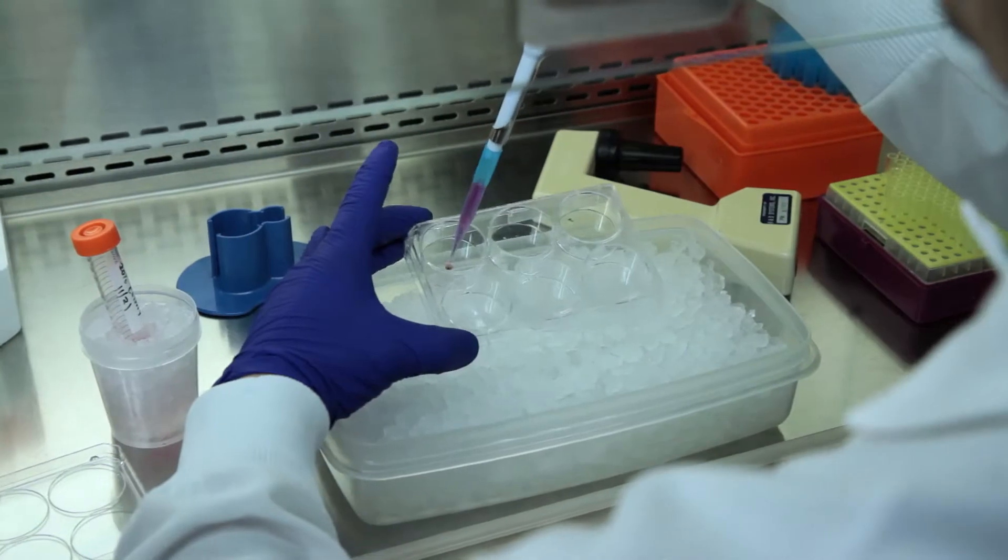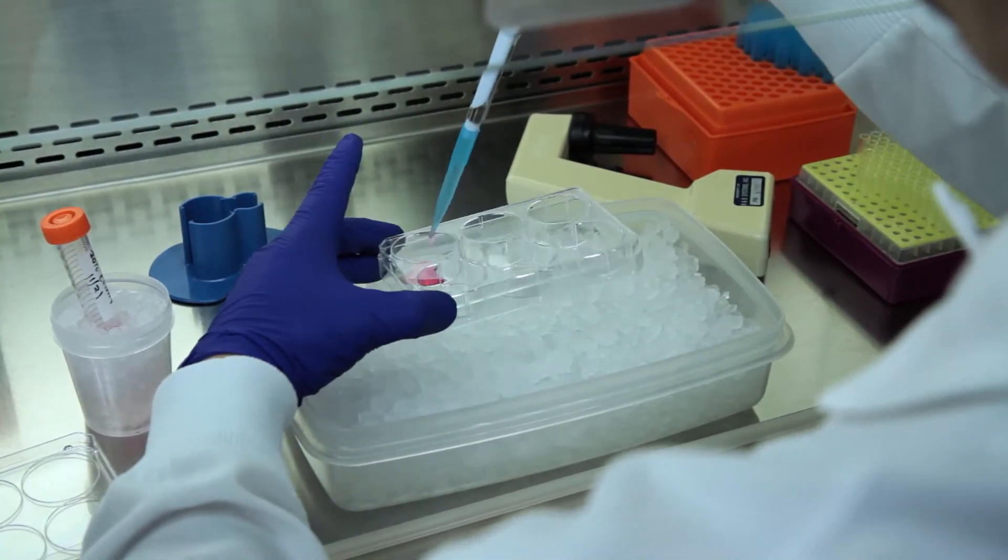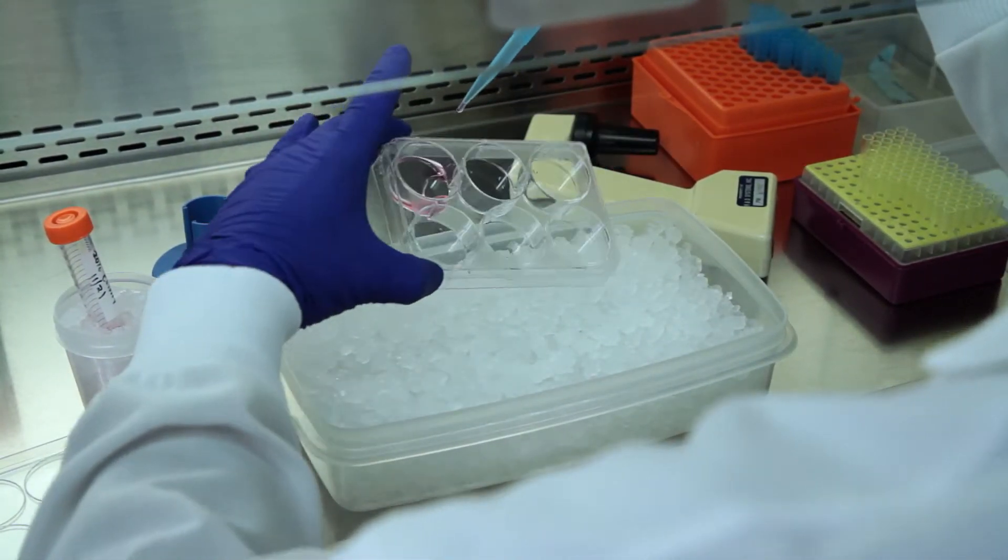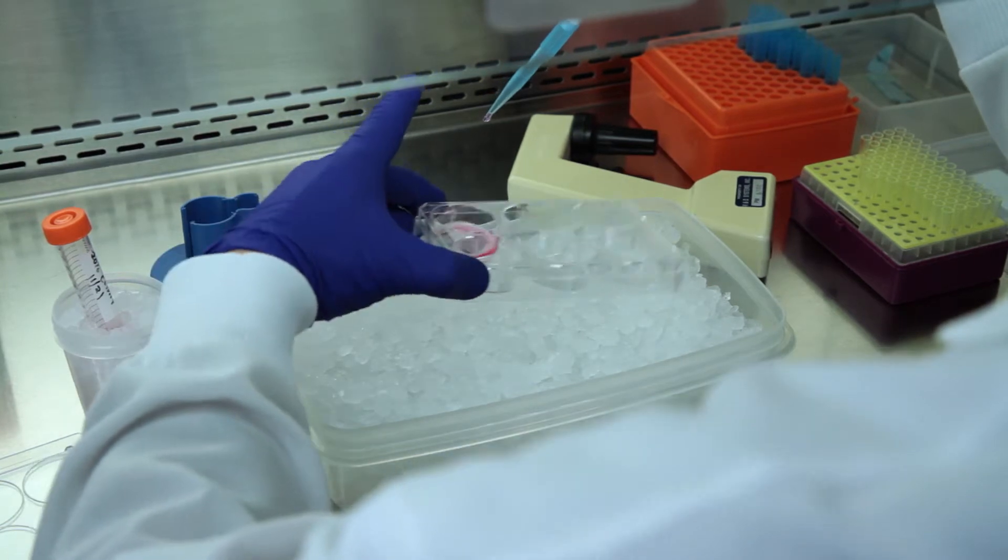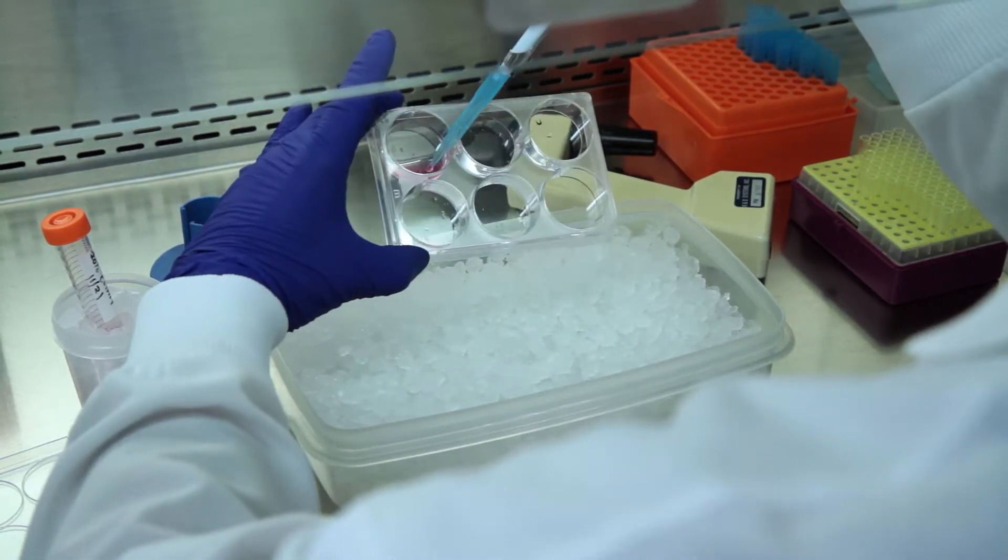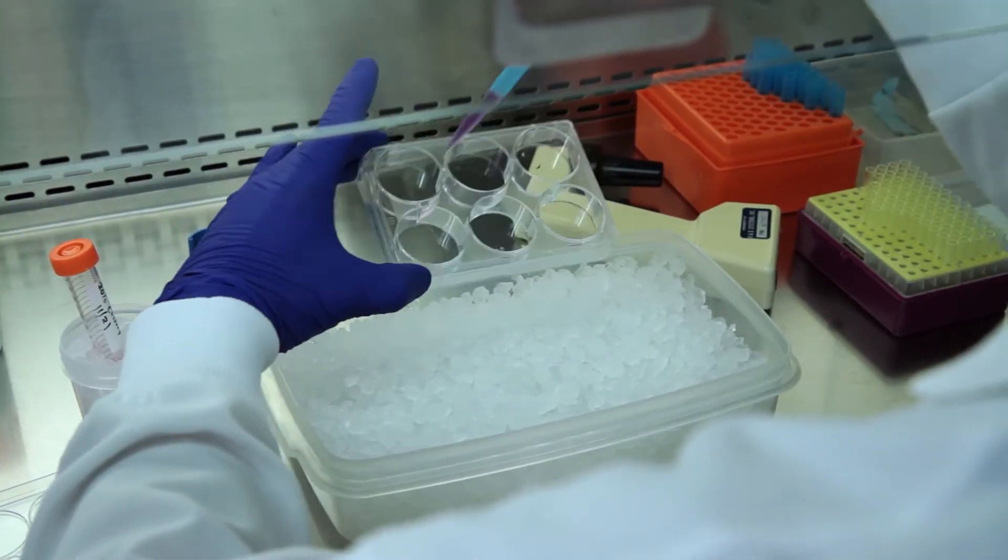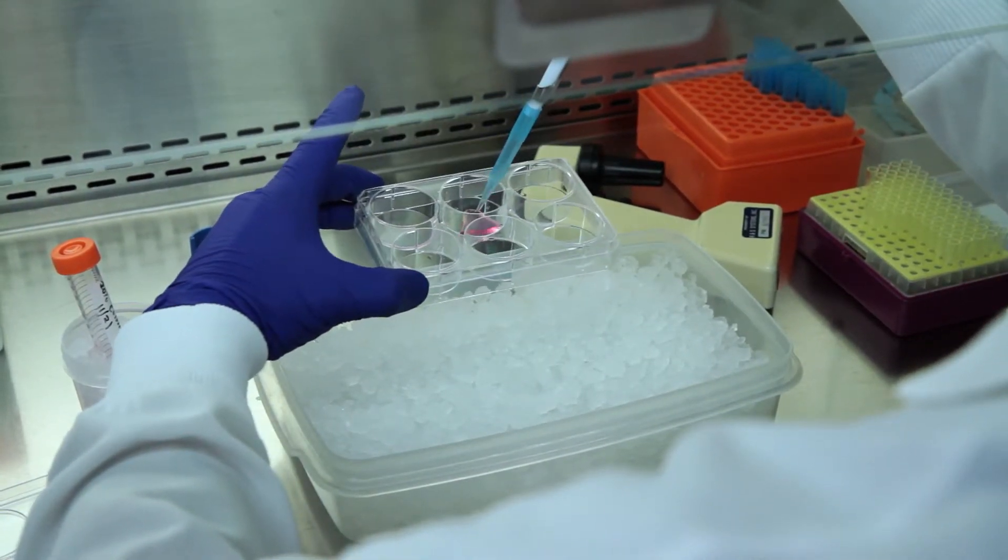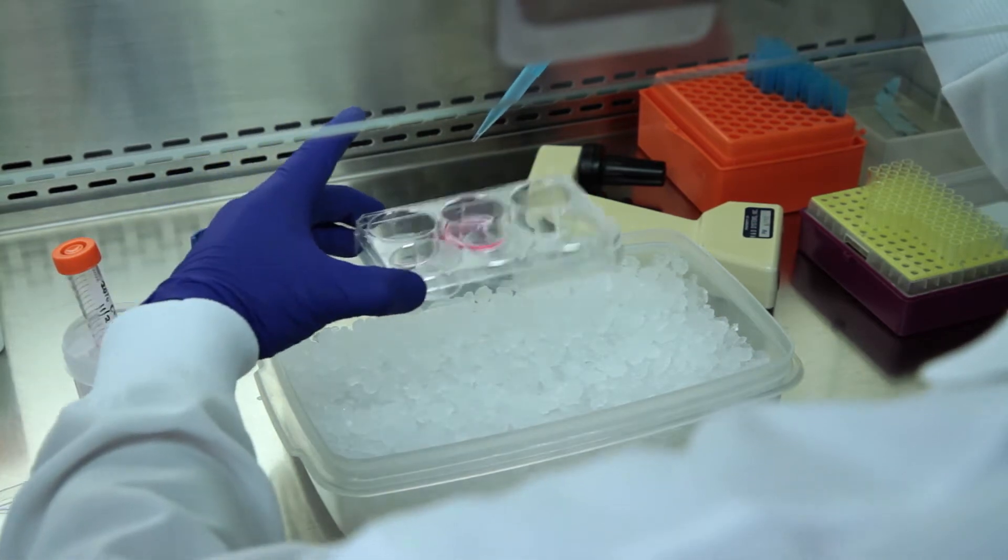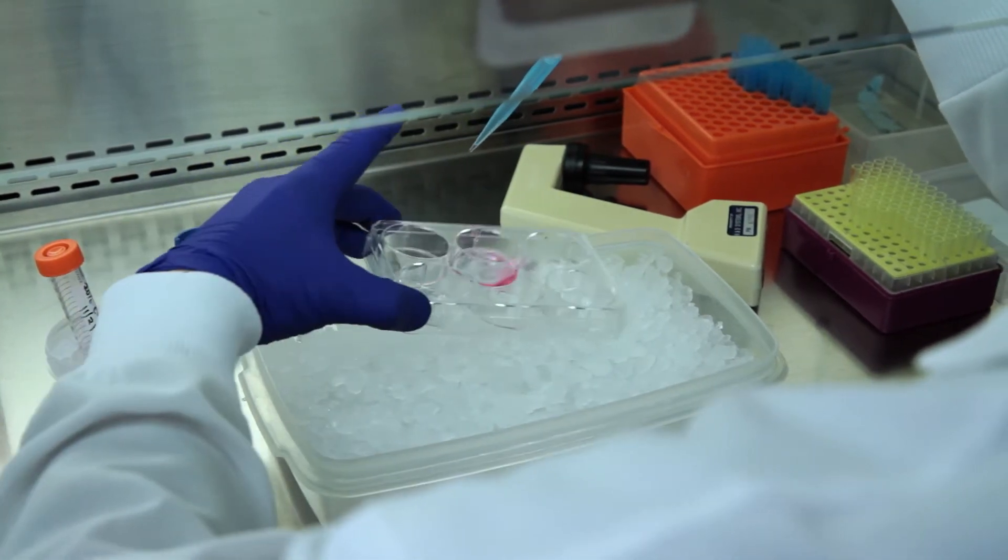To coat a six-well plate for stem cell expansion, pipet diluted Coltrex BME into the center of the well. Gently swirl the plate to evenly coat the well. Tilt the plate to collect the Coltrex BME and transfer it to the next well. Be careful to avoid introducing air bubbles during the coating and well transfer.